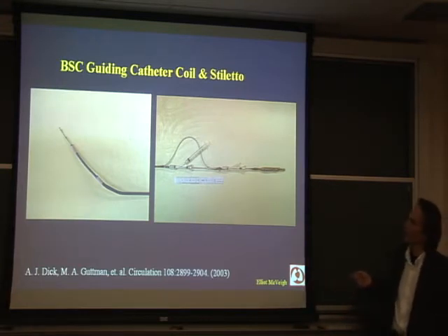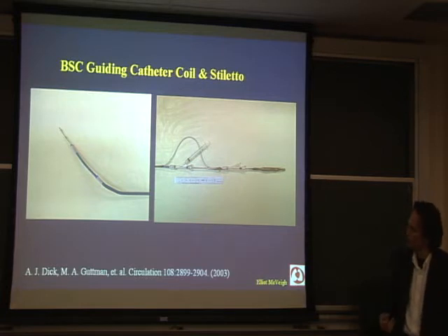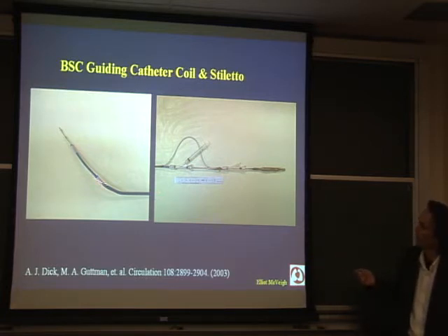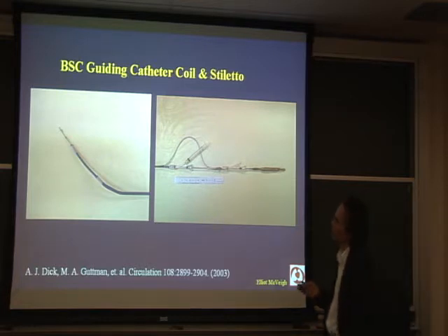And the device that the physician uses once inserted into the femoral artery and up to the heart. This is one such device that fits the injection catheter. The business end here has a needle, and there's a syringe on the end of that to inject whatever you'd like to inject for tissue therapeutic use.